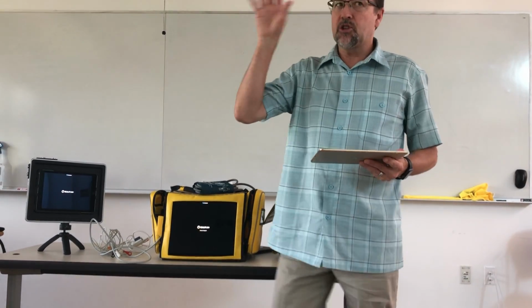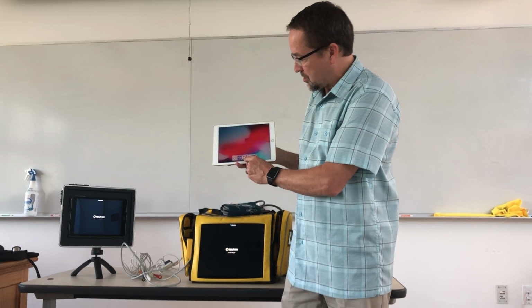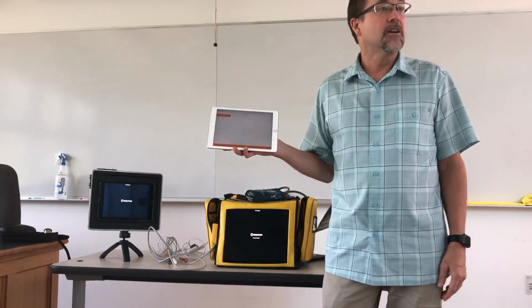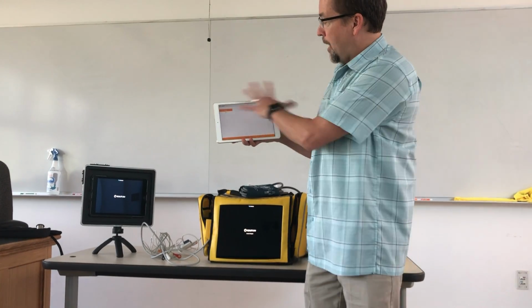If you have students running a scenario and other students watching, like for a class participation thing, they have a free app. The image looks almost exactly the same, except it's got little people in the center of the circle, and it's called Reality Engage. It's a free app that you can put on any iOS device, so it's only iPhones or iPads. But it pops up like this.